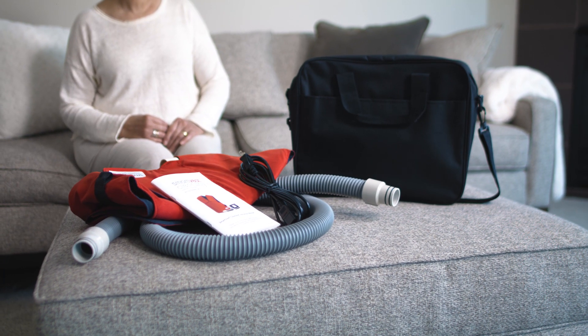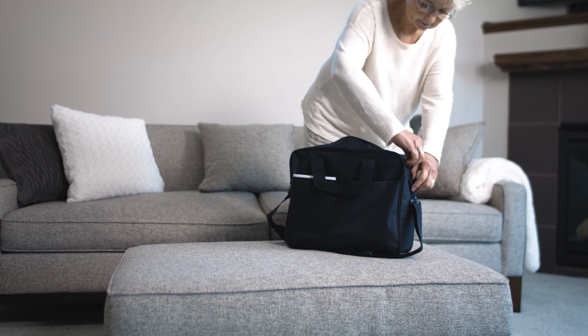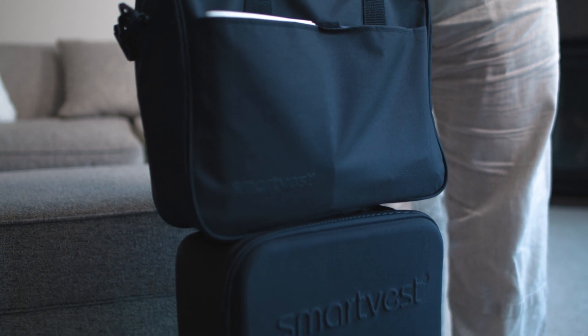The accessory bag stores the SmartFest garment, connecting hose, user manual, and generator power cord. The trolley sleeve slides over the wheeled carrier handle for easy and convenient portability.